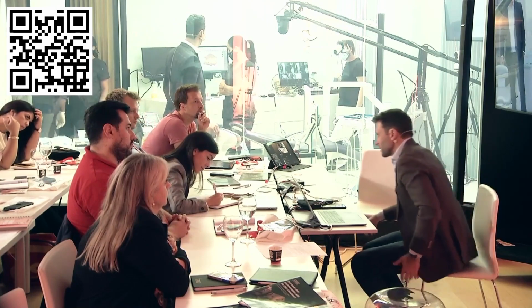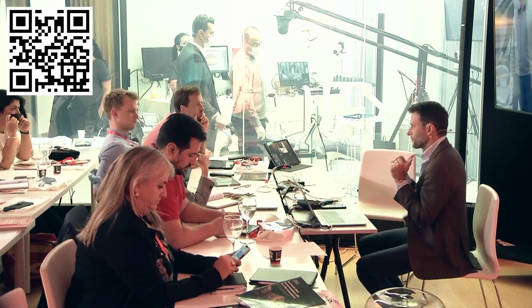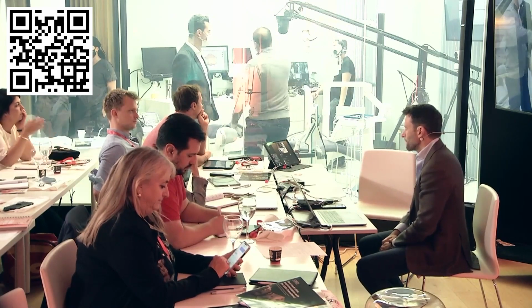It's like the patient is coming with a bad bridge and you want to design a new one. So it's the DSD protocol starting. You do the 5 pictures, you do the video with the bridge, and then we bring this back to the software. The wax up will be matching that, and then we're going to fix according to what we see on the documentation. You can also shape things in the mouth.